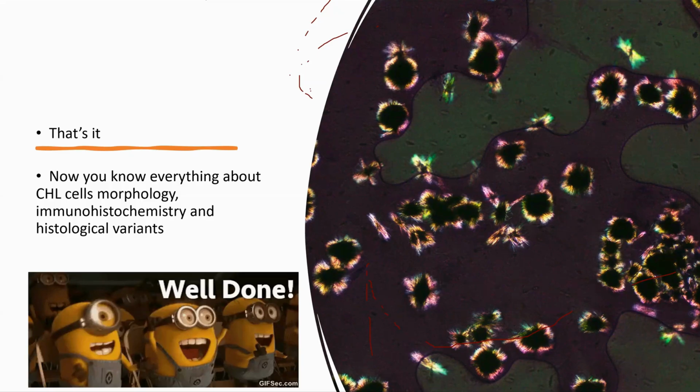The other thing you mentioned on your slide is that CD45, or leukocyte common antigen, is negative in classical Hodgkin lymphoma. I know you're just about to come on to the differentials, but many of the differentials for classical Hodgkin lymphoma will be positive for leukocyte common antigen. So that also is a good one. CD15, I agree, is often weak, maybe patchy, and sometimes just negative. The other question is, what is meant by compressed interfollicular areas?